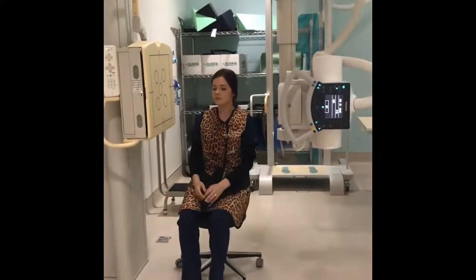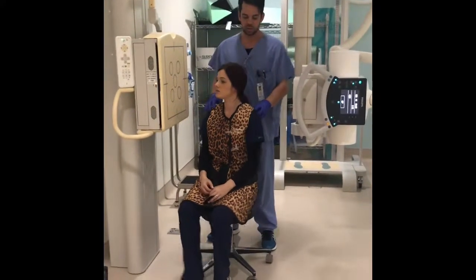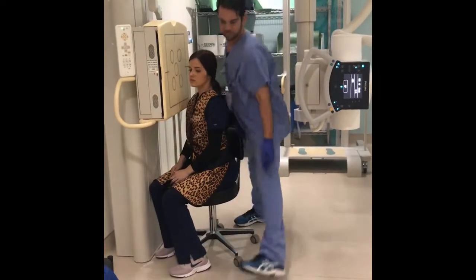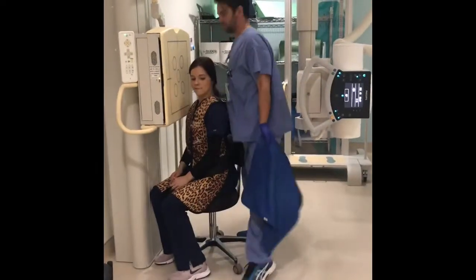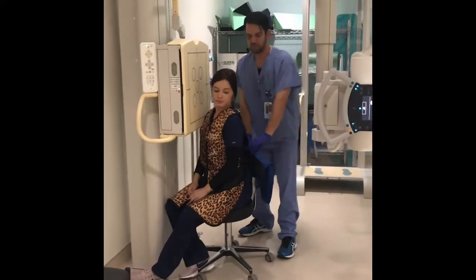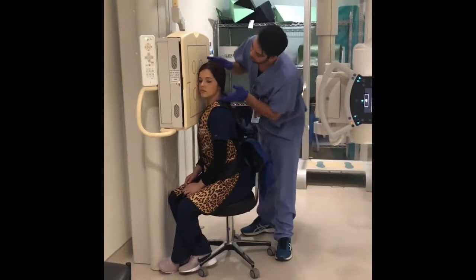Okay, so we're going to start our series with the lateral projection. I'm going to slightly oblique the patient to reduce OID.